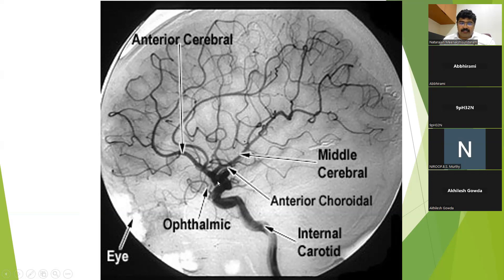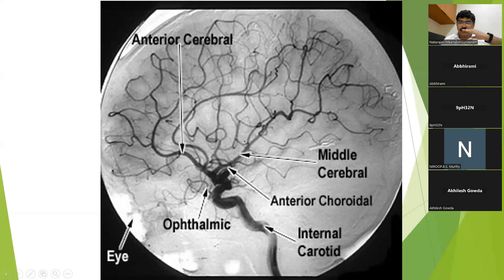The ICA terminates into the ACA and the MCA. Just distal to the PCOM lies the anterior choroidal artery. The anterior cerebral artery further divides into the callosomarginal and the pericallosal artery. The callosomarginal artery lies over the cingulate sulcus, just above the cingulate gyrus, and the pericallosal artery sits over the corpus callosum.